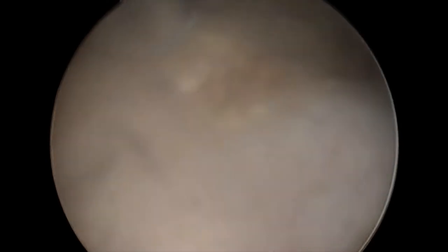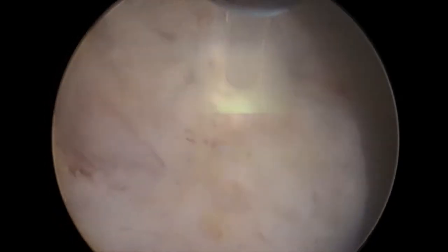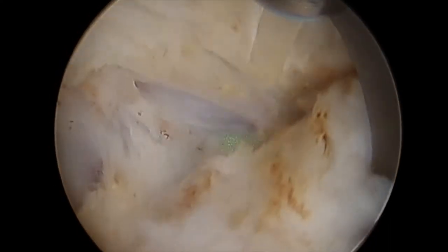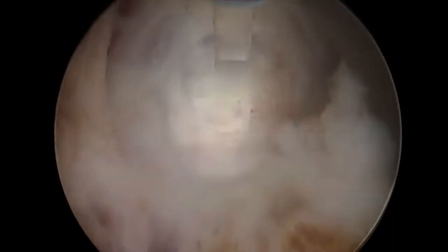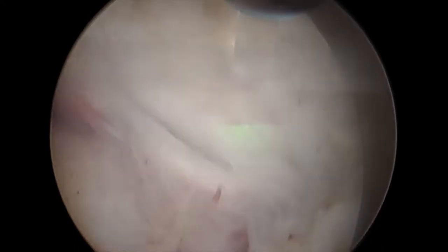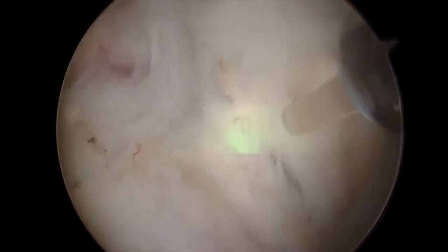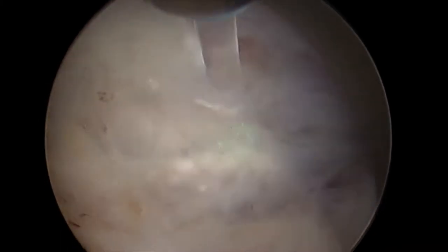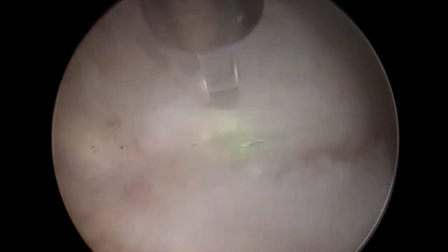You can clearly see at times here, on the right-hand side of the picture — at this point the anterior part — the shell of the prostate, and to the left of the laser, or below the laser, we can see the adenoma, which is the white balls of tissue which are causing the problem.